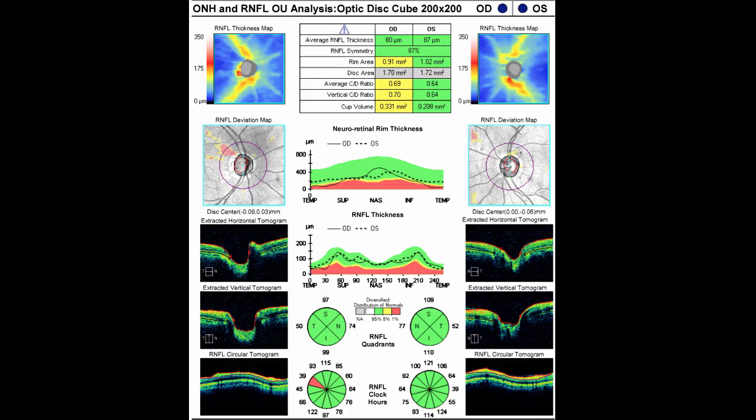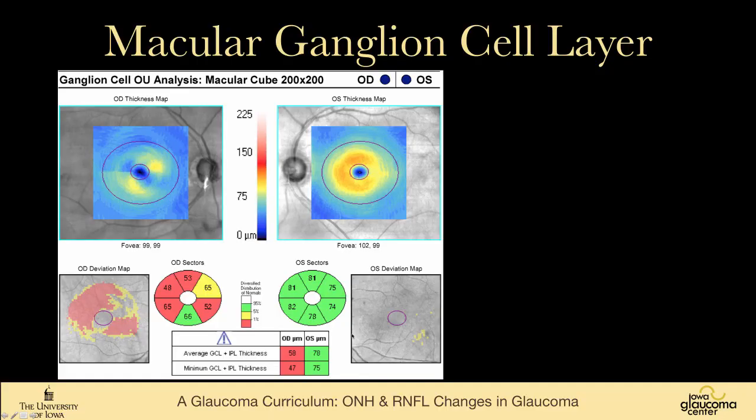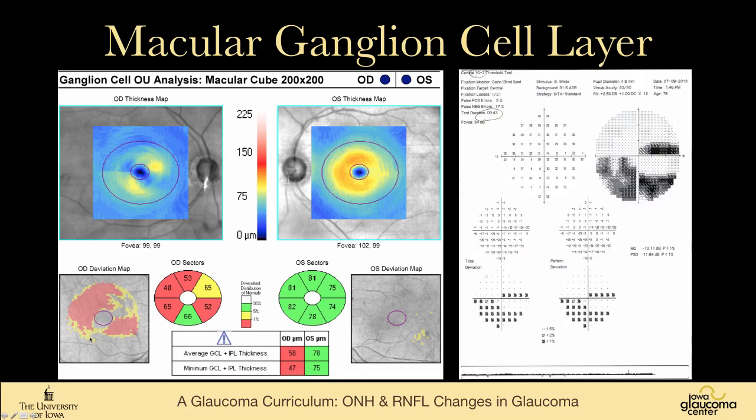When we look at this patient's OCT, it really doesn't look that bad. The retinal nerve fiber layer thickness has one little area that's thin, but overall not startling. But when we look at the ganglion cell layer of this right eye, you can see that it's very thin, and that's reflected in this 10-2 visual field showing substantial loss. So over time, we're becoming more aware that the macula is not protected in glaucoma, and the ganglion cell layer analysis is very helpful in looking at this.